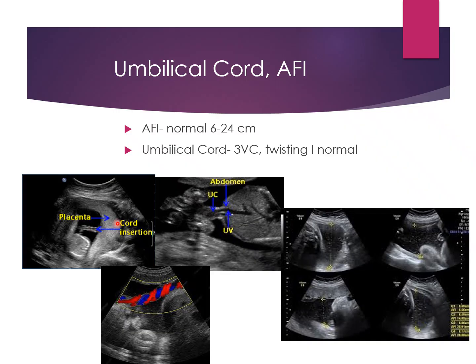The other thing that we want to show is this blue-red twisting pattern of the cord with color flow, and then at the bladder showing that we have the umbilical arteries wrapping around the bladder. You can also do a transverse view, and we're kind of getting a little bit of it here, not pretty like we would want it, but showing that 3 vessel cord. So you should have your cord with 3 anechoic circles inside of it, and we would put color on that just to demonstrate that we have 3 vessels.